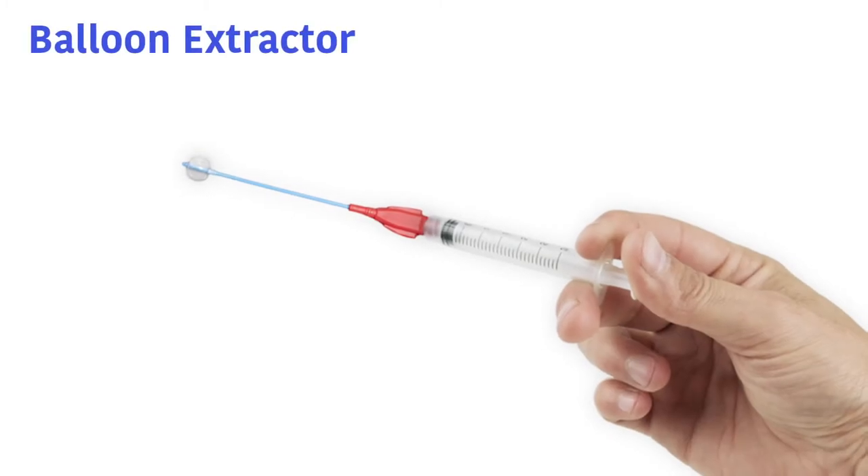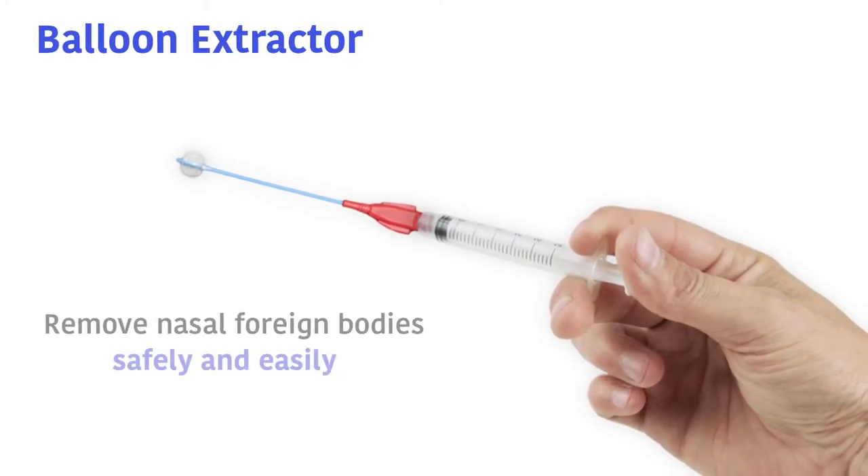Introducing the MarMed balloon extractor. The balloon extractor is used to remove nasal foreign bodies safely and easily.